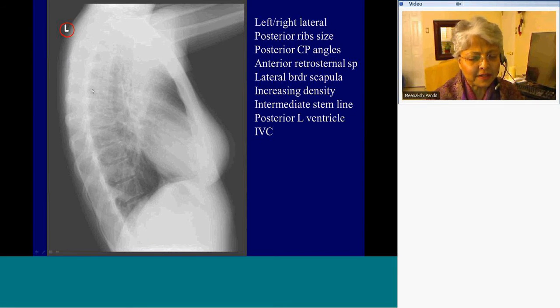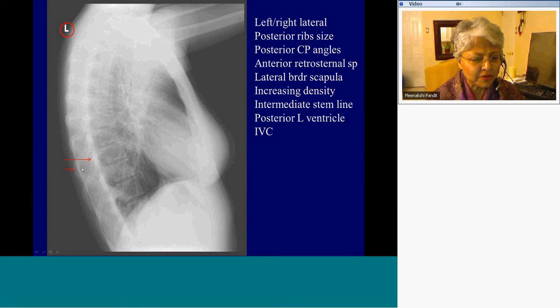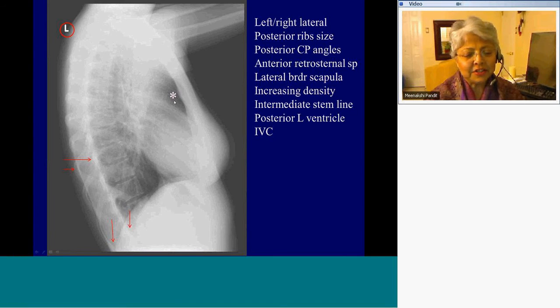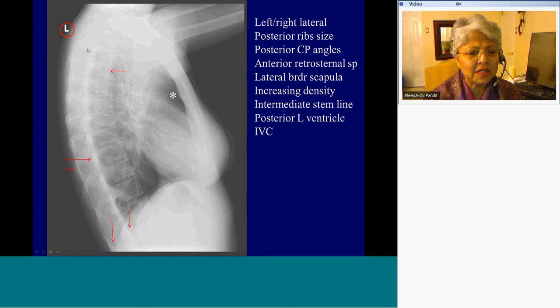Left lateral view — indicated by the radiopaque marker — tells us that the left side of the patient is closer to the radiographic plate, which means the right would be more magnified. You can see that the right ribs are much larger than the left ribs, and we can identify the right and left posterior chest walls. The corresponding costophrenic angles are delineated here. This is the anterior retrosternal airspace to watch for in case of anterior mediastinal abnormality. You can see both lateral borders of the scapulae along with the parascapular muscles, causing increased density in the upper hemithoraces on the lateral view.